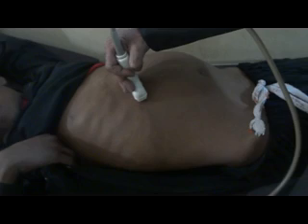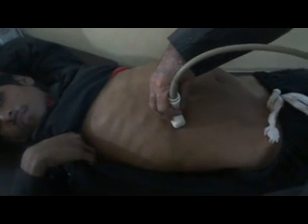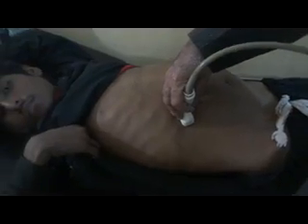This is the area of a solid mass in this 20 years old young boy with no history, no clinical notes, no lab findings, and no other investigation, for example X-ray, etc. Nothing is provided. So we will start with the subcostal approach, and we see that the liver is not seen below the costal margin.